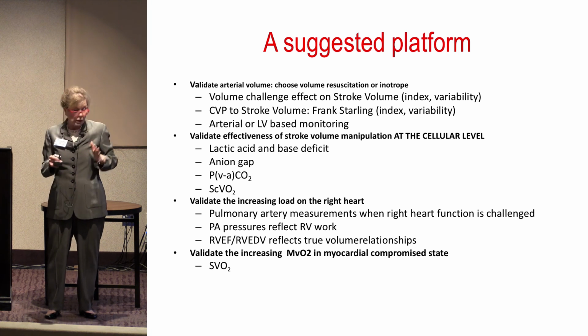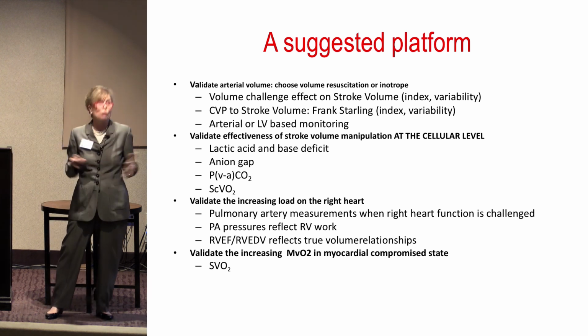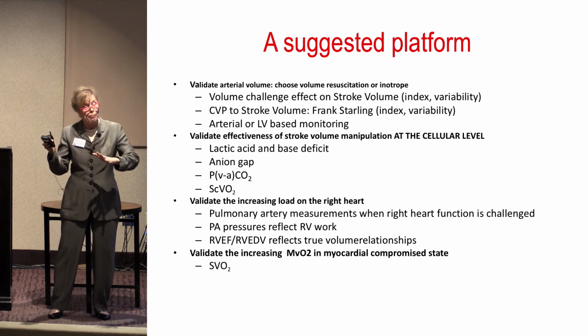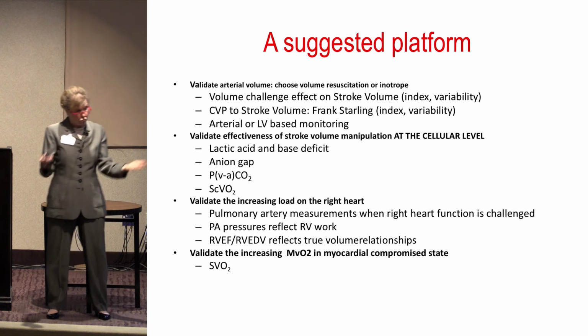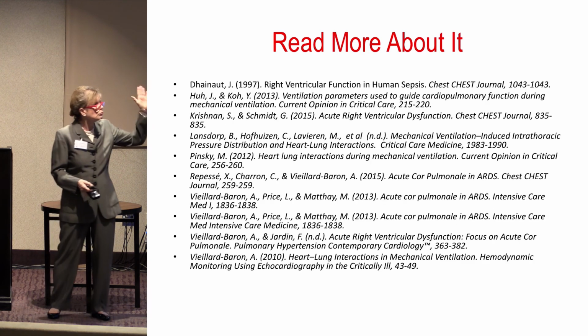And if we are doing aggressive ventilatory management, what we're seeing on chest x-ray, you have a high degree of extravascular lung water because we're seeing that you have infiltrates. Now we're going to consider, do you need a PA catheter to help me maximize right ventricular ejection and right ventricular filling in order to maximize blood flow dynamics? So it's a wide platform. There's no one answer. Read more about it.